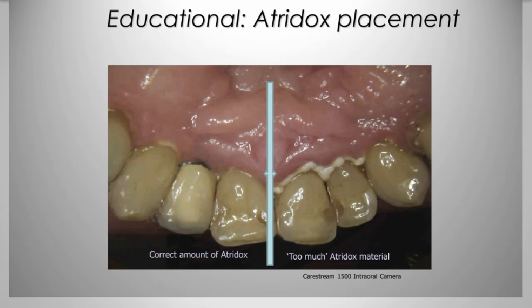Now, as a consultant, I've done this. I'm going to tie in a little bit of periotherapy here for a second, but this is pretty neat. I believe this camera was the Carestream 1500 intraoral camera. And I use intraoral camera technology when I'm training hygienists during my in-office hygiene consultations. And we see patients a lot of times in the morning. We'll see them for the left side, let's say, for scaling and root planing, using ultrasonics and placing locally applied antibiotics. And then we go in the afternoon and we usually finish up the case.